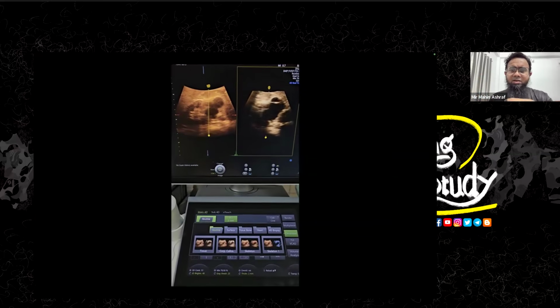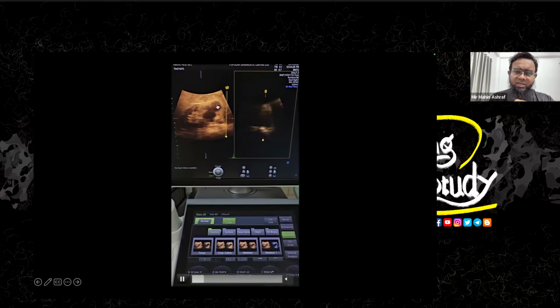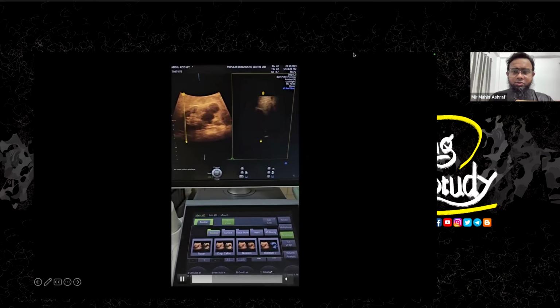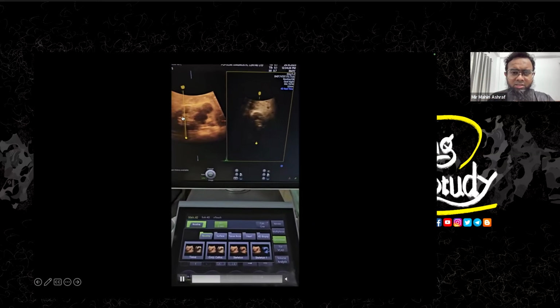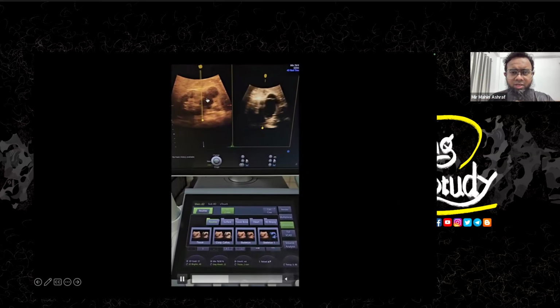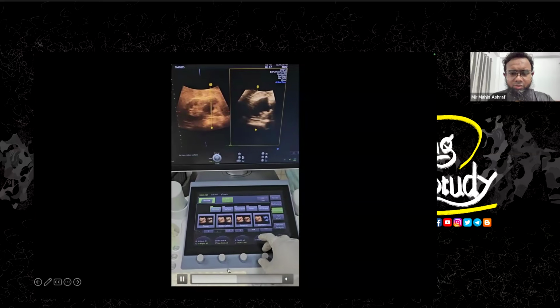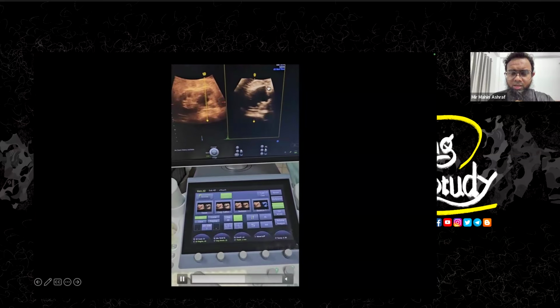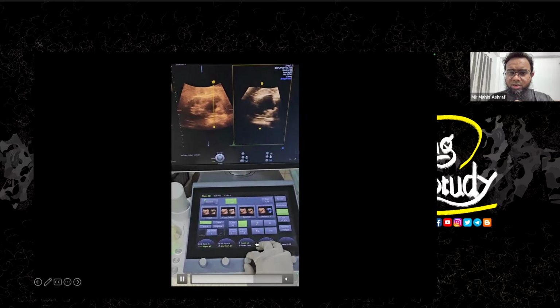So here is another picture where I'm using the Omni View option. This patient had a cyst, I think 2 cysts here. So I was confused, sorry for the data anyway. I'm just changing the multiplanar format. I'm just moving it from here to here, and I want to see this area. And now you can see that when I'm changing the part, the cyst is not two in number, rather it's a single cyst which is quite large.